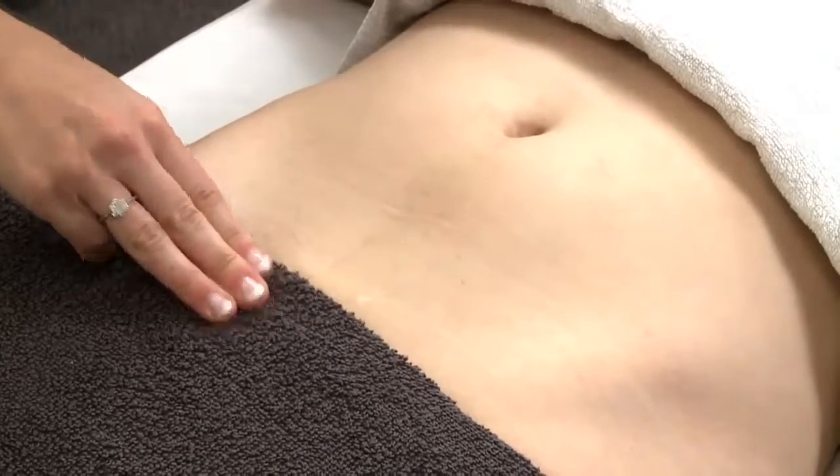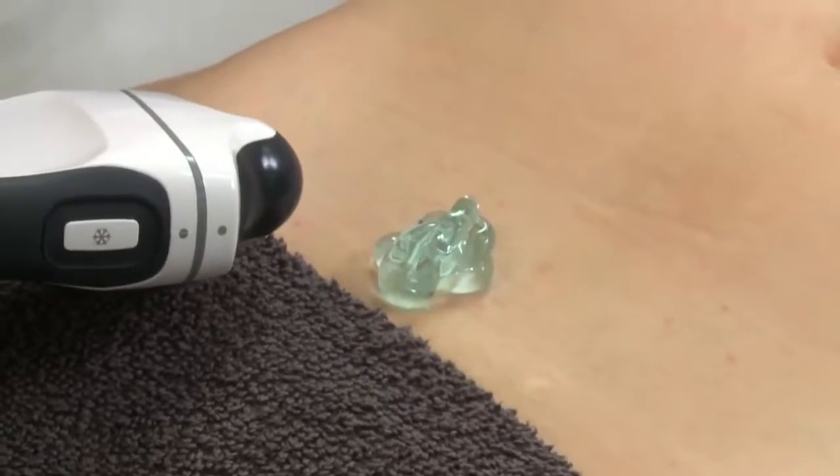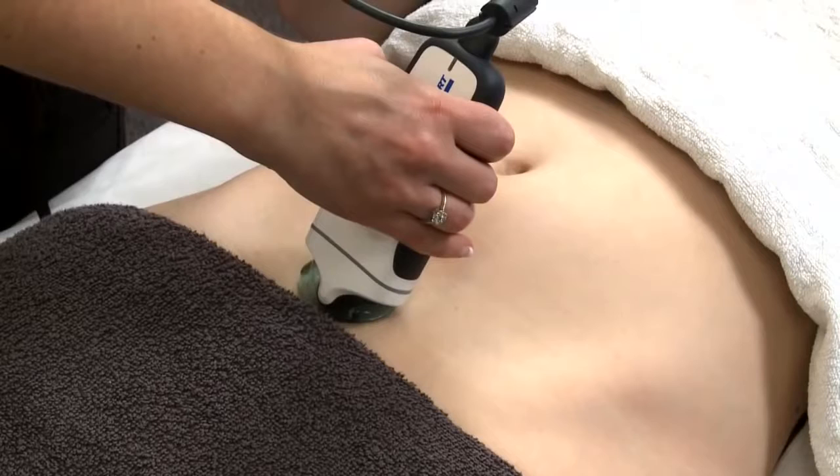Place gel on the patient with the silver orientation dots on the probe towards the patient's right side. Place the probe one centimetre above the pubic bone and point at about 10 degrees downwards towards the patient's feet.